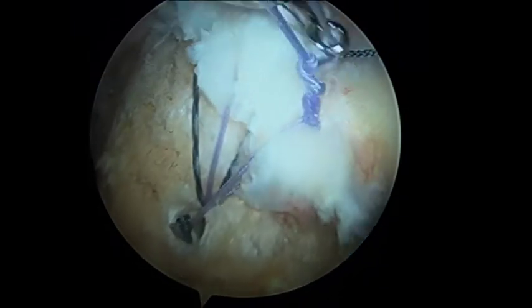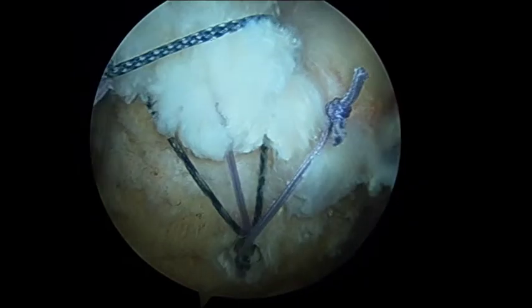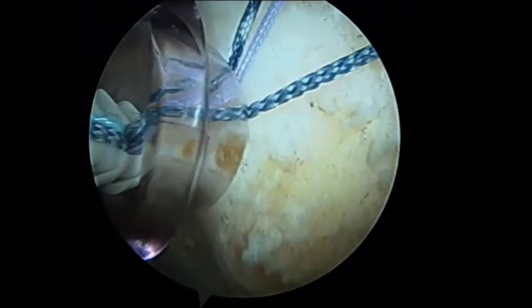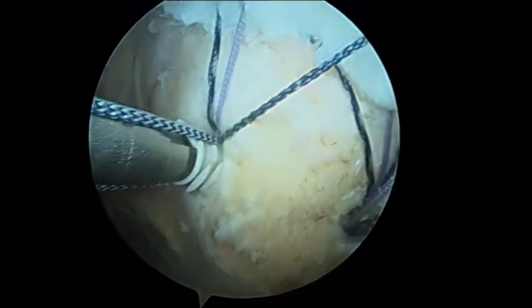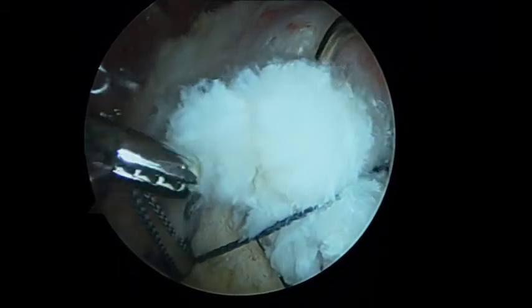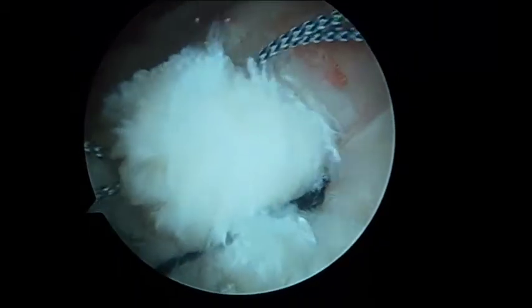If a second lateral row anchor is to be used, the remaining limbs from the mattress sutures are incorporated into the anchor and then placed into the greater tuberosity. As seen here, an additional suture is incorporated into the second lateral row anchor and an additional simple knot is tied, further reducing the cuff tissue to the footprint.